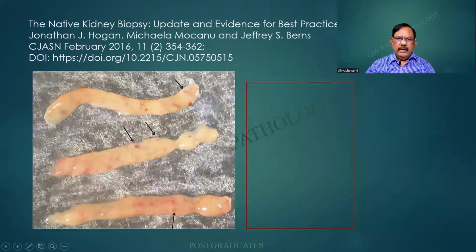And this is the reference for this beautiful set of pictures. I would like to appreciate them, thank them, and also guide you people to them. And look at this over here. They are not just taking a single strand, they are taking 3 or 4 strands of these biopsy tissues, whatever be the millimeters they are in.